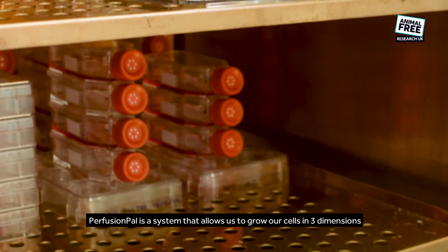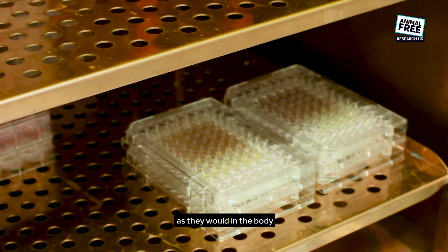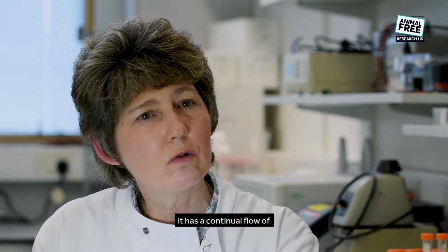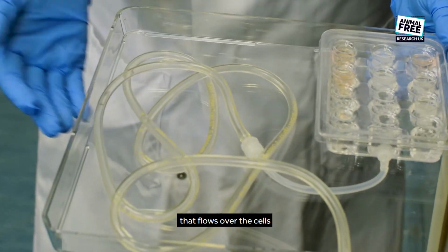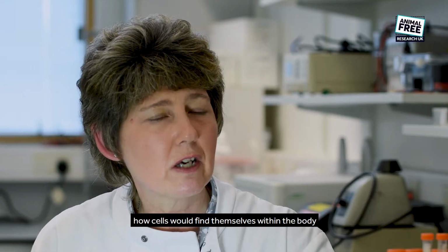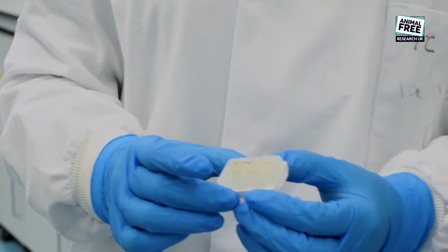Perfusion Pal is a system that allows us to grow our cells in 3 dimensions as they would in the body. It has a continual flow of what's called an artificial blood substitute that flows over the cells, which is exactly how cells would find themselves within the body. So that's a really new model that we're starting to develop.